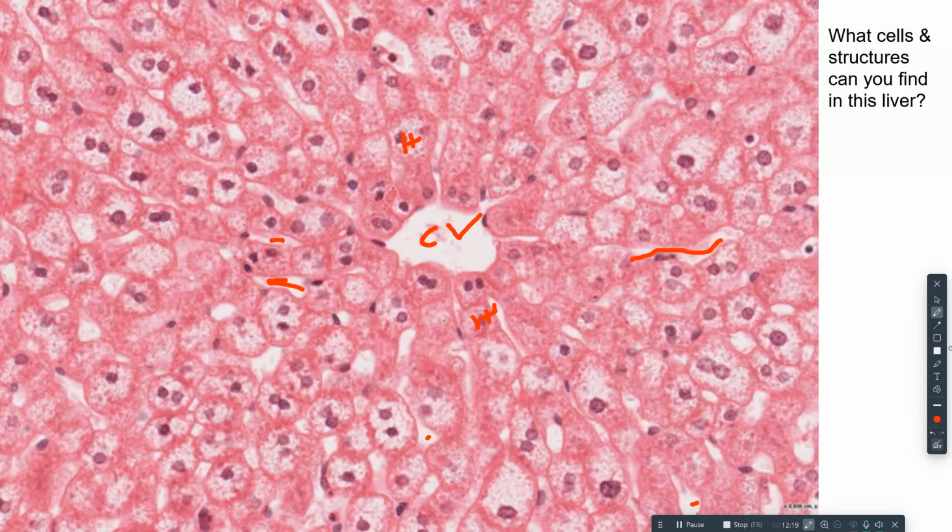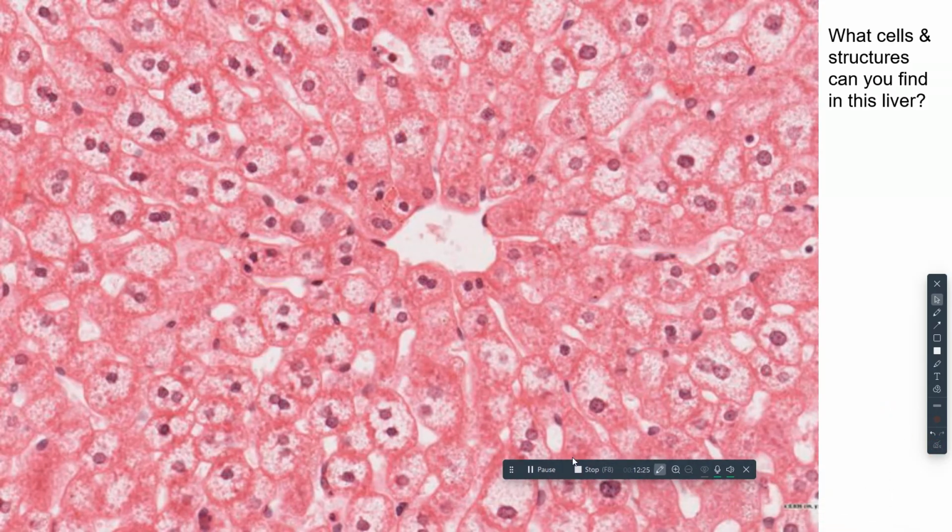Okay, was that our last slide? Might be, let's see. Yes, another super quick lab video, which is great. Still did a bunch of organs, but we ripped right through them, which is kind of the nature of the game in these videos here. So, 12 and a half minutes, 13 minutes, and we are done.